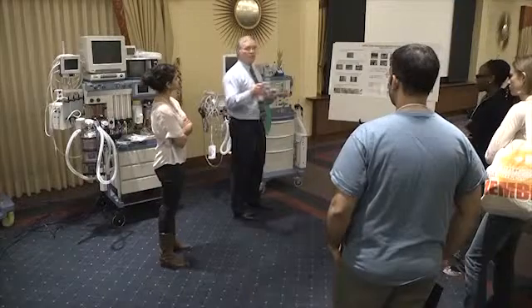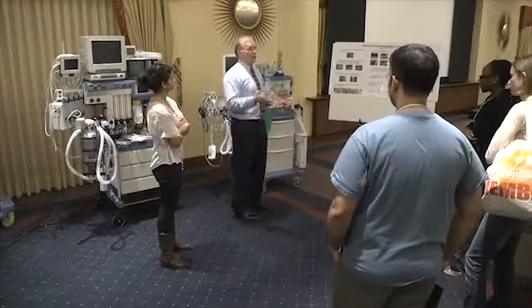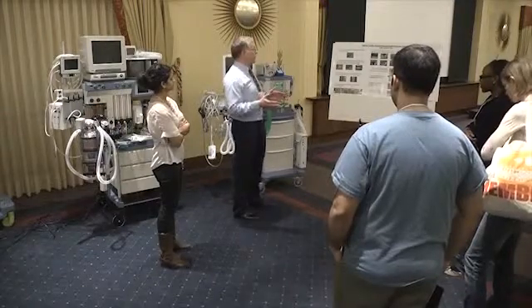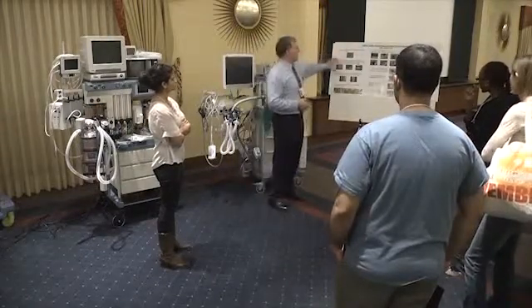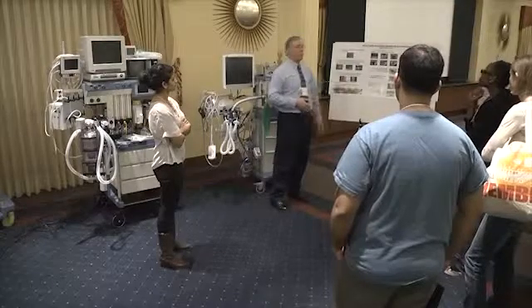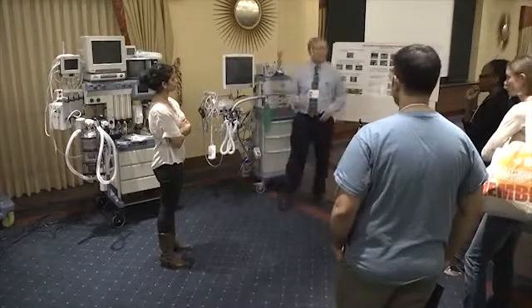It isn't that now you're on battery backup and you've got half an hour to think about what you're going to do. Your machine just kips out of it. All right? So make sure you have power. The next thing we want you to do is check your oxygen cylinder and check your pipeline supply. And we talked about this in great detail.